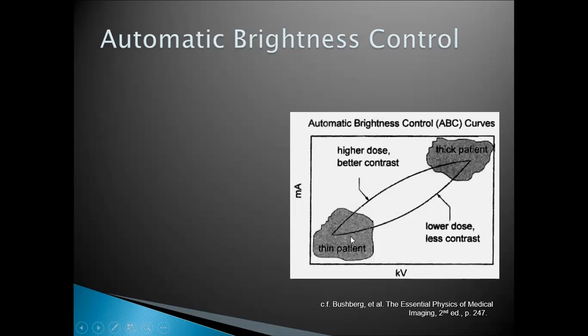If we increase the kV, we are lowering the dose, and of course we are getting less contrast.